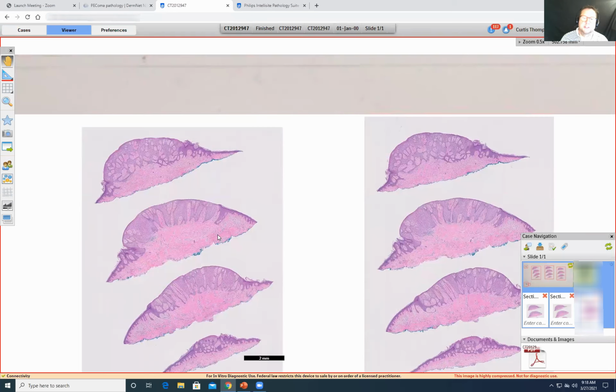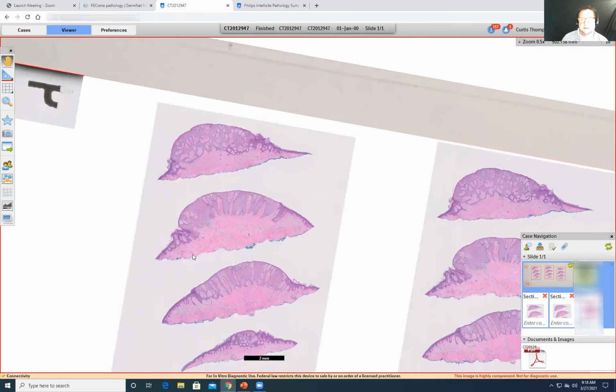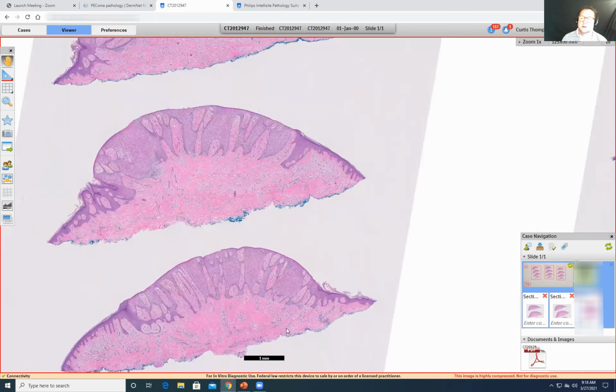Here you see a nice, so this is number 11, 73-year-old male, pre-tibial patch, rule-out dermatofibroma. Well, you can see why it's considered a dermatofibroma. It's dome-shaped, sticking out, pre-tibial. But then you can see something's amiss here.